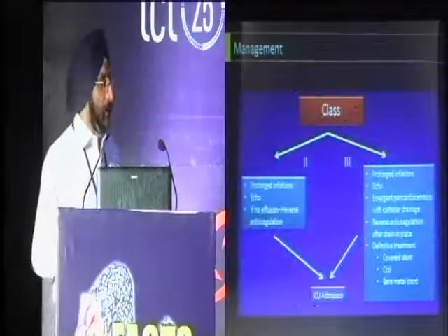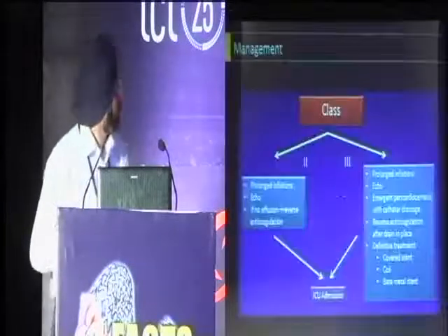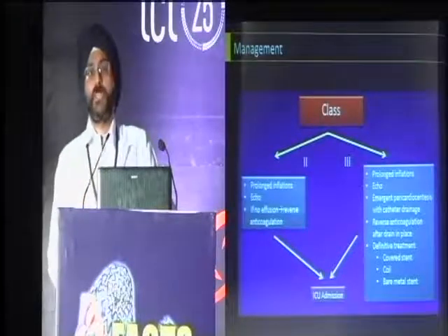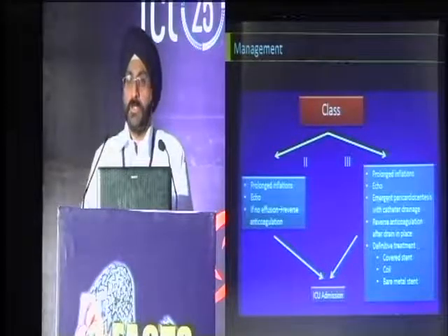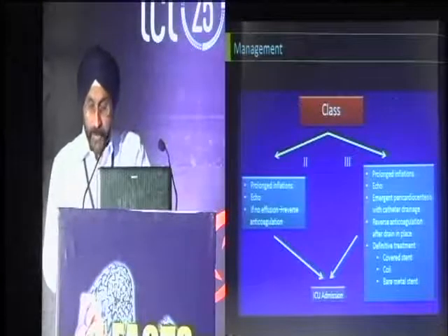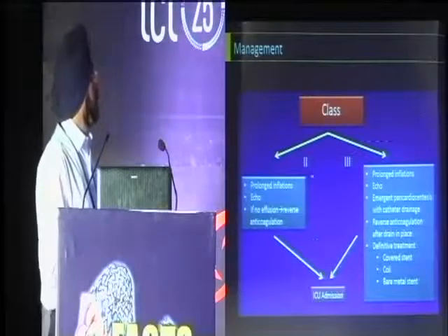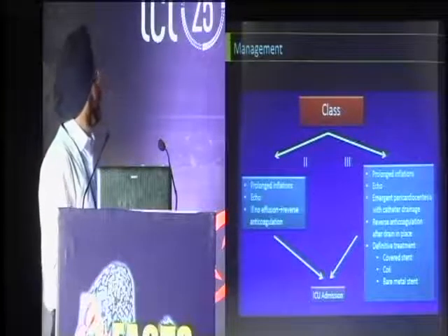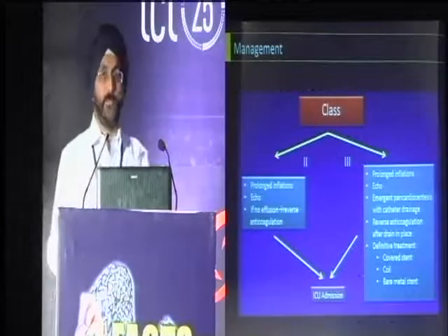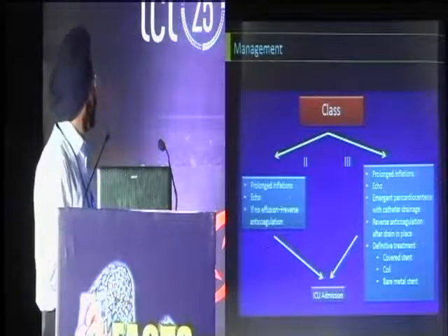In the next 2-3 minutes, I'll just mention briefly how to handle these. I have already told you class 1 perforations are simple. You just have to inflate a balloon proximal to that, and sometimes even stenting can definitely seal that. In grade 2 and grade 3 perforations, the important point is that you have to give prolonged inflation. Prolonged inflation is the most handy thing which has to be done immediately. This is very common sense actually.